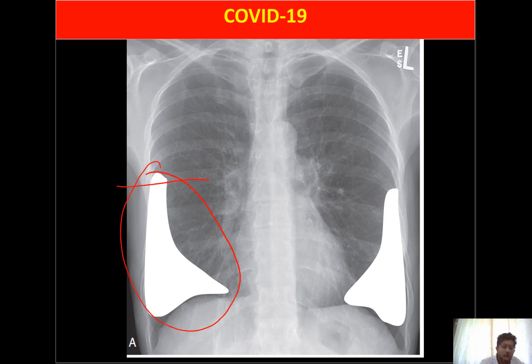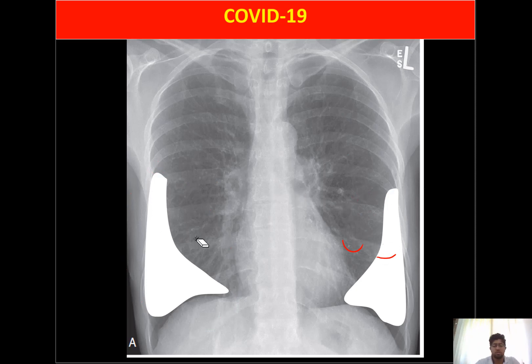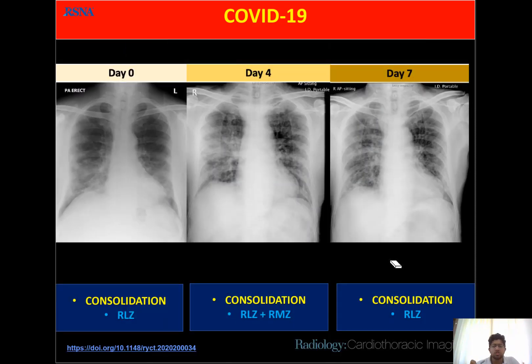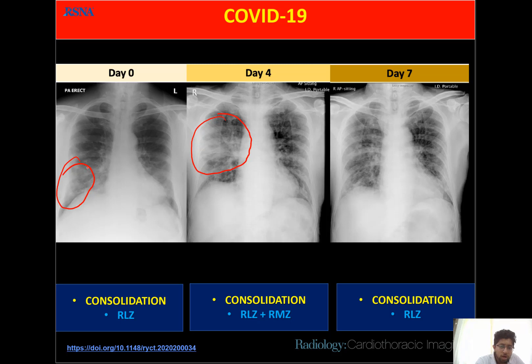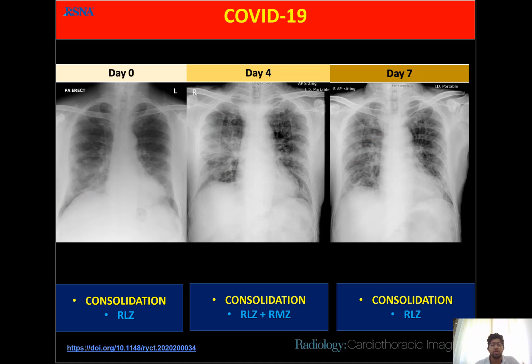The disease shows peripheral zone and lower zone involvement with bilateral symmetrical distribution. Looking at a patient's chest radiograph — a patient who had traveled to Wuhan, China where the pandemic started — three chest radiographs were taken on day zero, day four, and day seven. On day zero, consolidations are seen in the lower zone. By day four, consolidation appears in the mid zone, and on day seven there was no consolidation in the perihilar region.